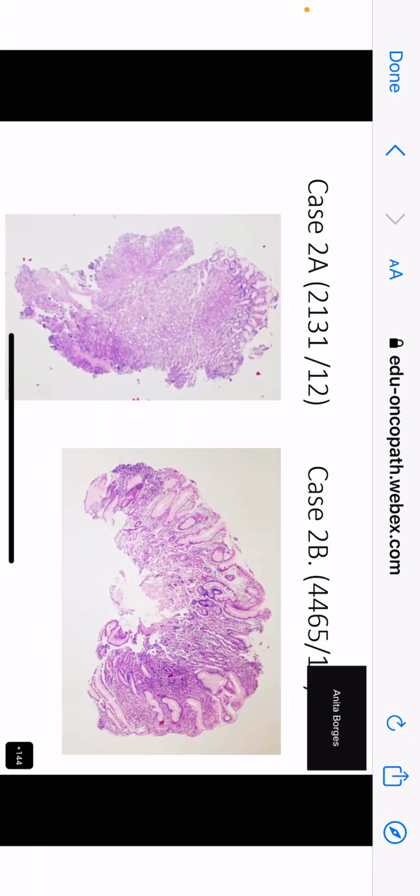No, ma'am. In body type of mucosa, there will be mainly parietal type of cells and also chief cells. Excuse me, ma'am, we are talking about the foveolar epithelium. What is the length of the foveolar epithelium with respect to the glands in the body mucosa? Ma'am, it will be shorter.